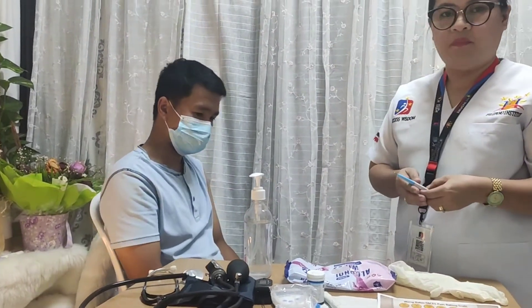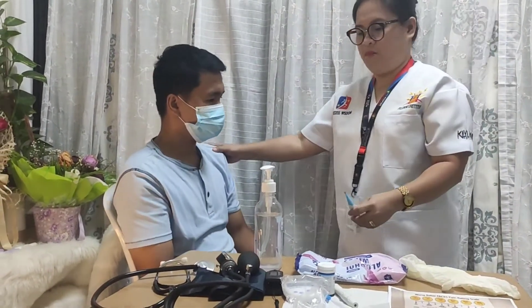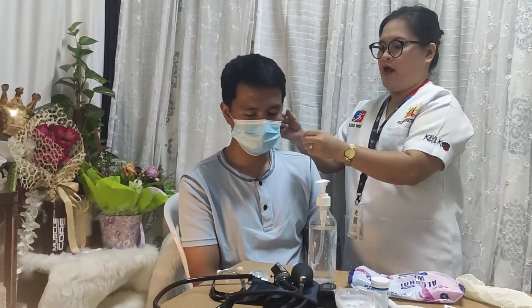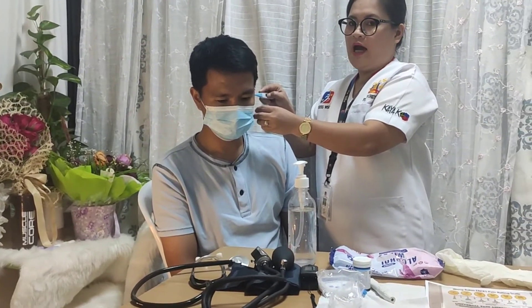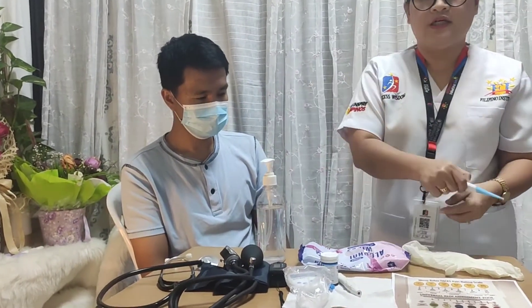Using the tympanic thermometer: cover the thermometer with the probe disposable cover. Position the patient properly with the ear in front of you. Pull back the ear gently, insert the covered probe, and press the button on. Hold in place until you hear the beep tone and read the result. Press the eject button, discard the probe cover properly, and document the result.